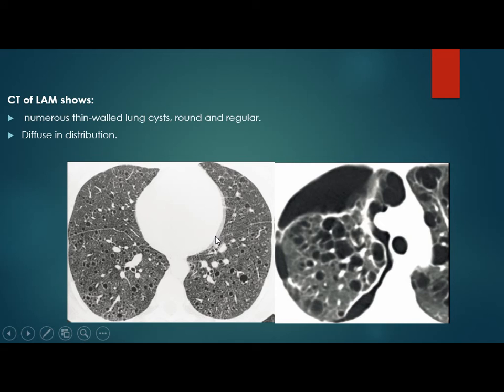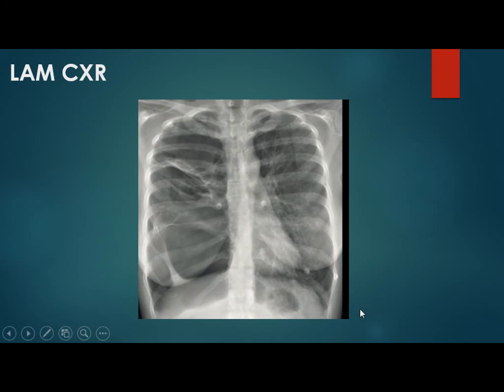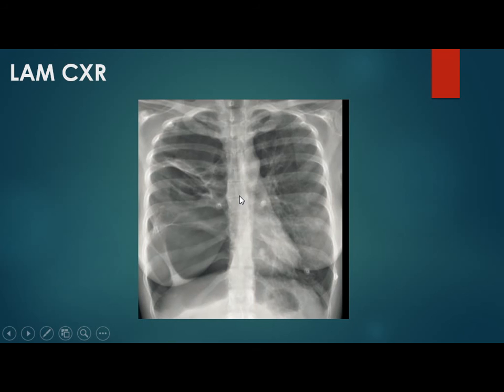There is pneumothorax in this case. On chest X-ray, we can see hyperinflated lungs with increased lung field size and reticulation. When reviewing the chest X-ray, we can see the breast shadow confirming this is a female patient.